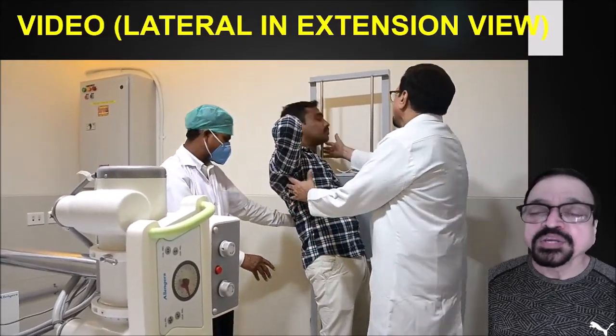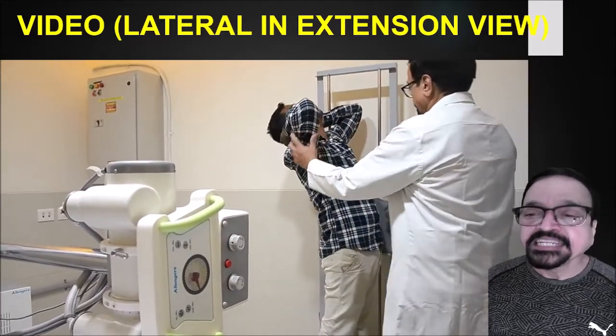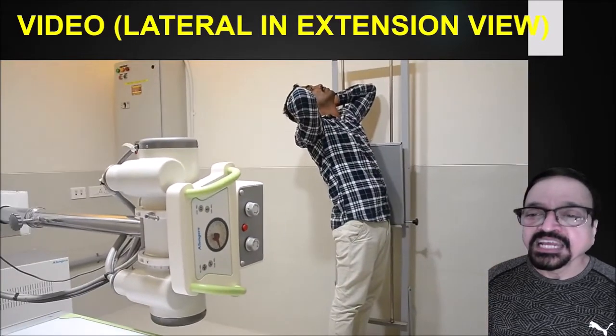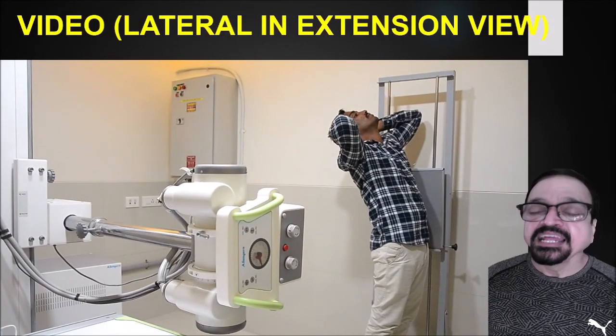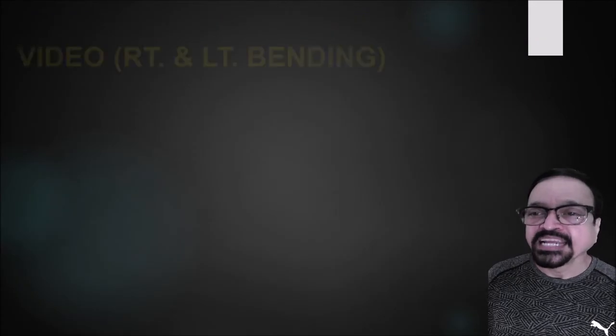He has to keep the plane same. Now see, the hand is coming in the way. It is adjusted so that the true lateral comes. A technologist has to see all these things, and once the patient is placed properly, you can go for exposures. Now centering will depend on the area of interest, whether it is L1, L2 or L3.